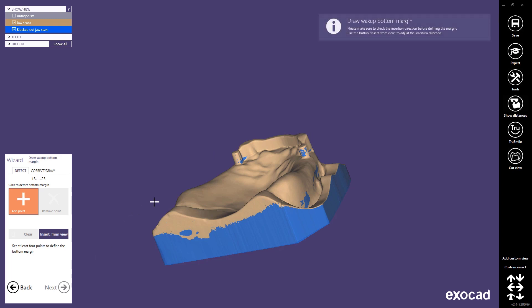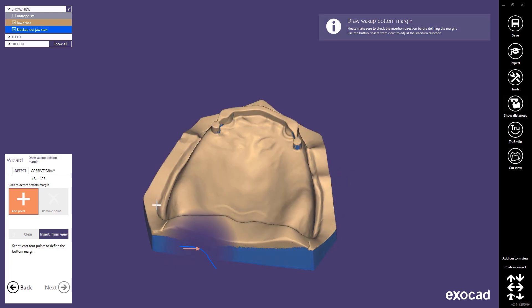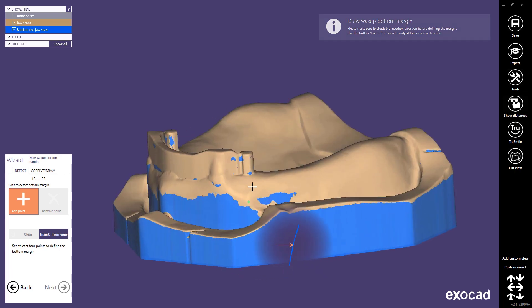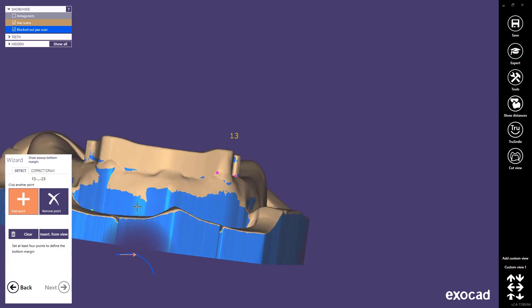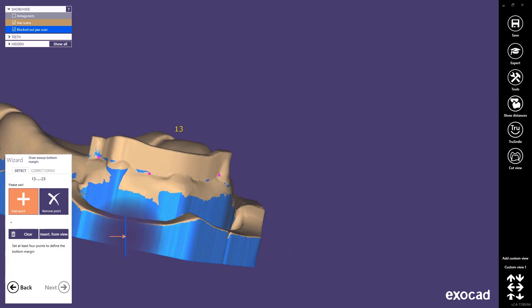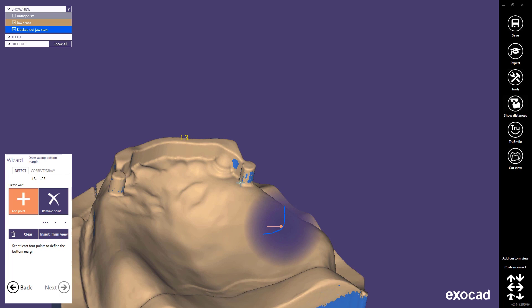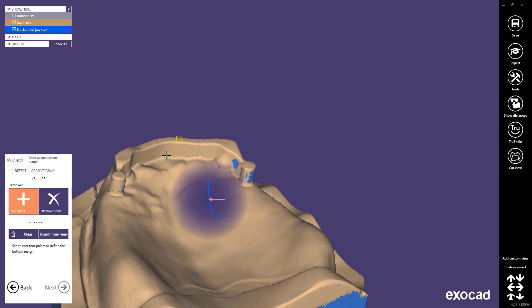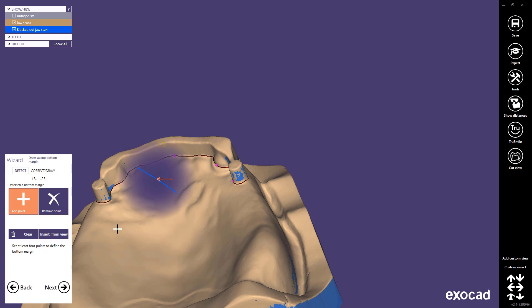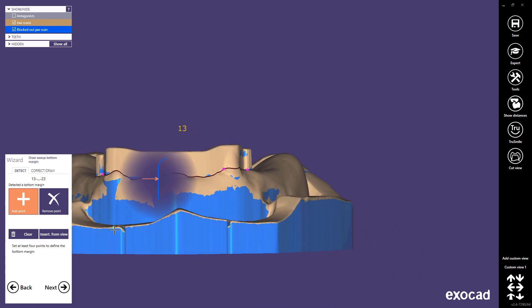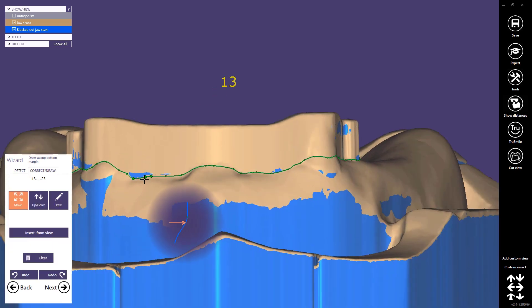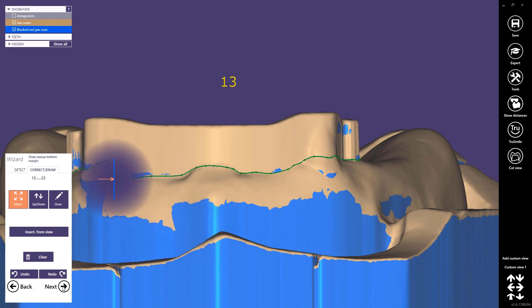In the next step we have to draw the wax-up bottom margin. You will also see that the blue model appears — this is the blocked-out jaw scan. You can change the block out by changing the insertion direction. Click on the model to detect the margin line. To modify or correct the margin line, please click on the correct draw tab and click on the green dots to move the curve. Press next to go to the next design step.